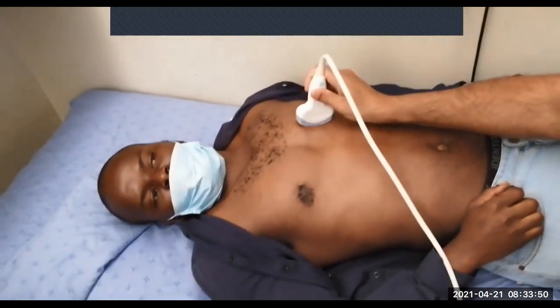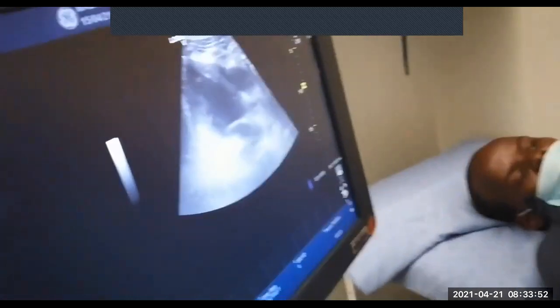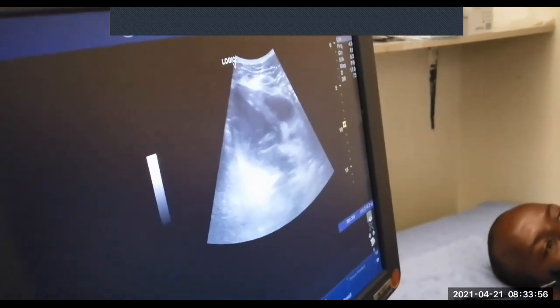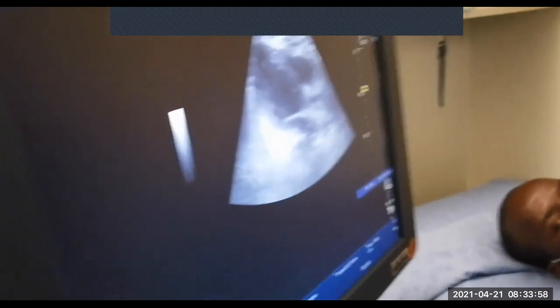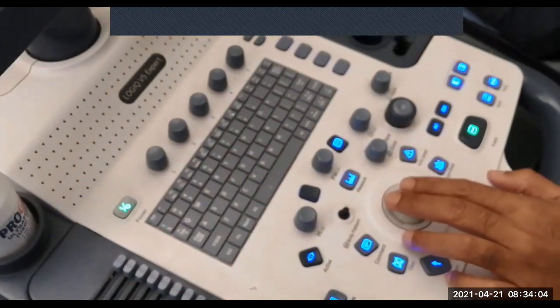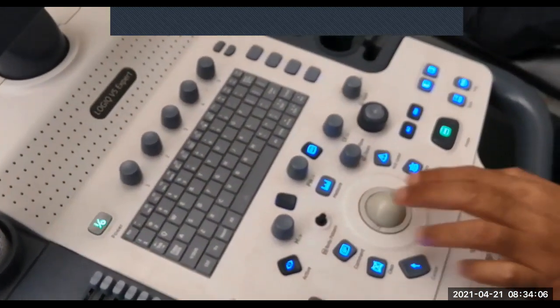All right. So now we're going to come to our minimum. We're going to look at how small the thing gets as well. So let's try and catch it there. We try and find it at its smallest diameter, which is more or less there. And let's just measure it again. All right. So we had 3.54. Has somebody got a calculator out?